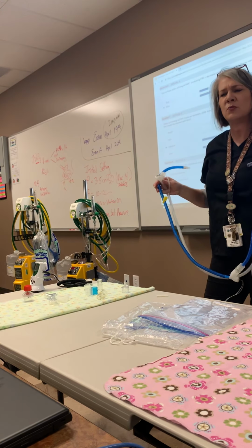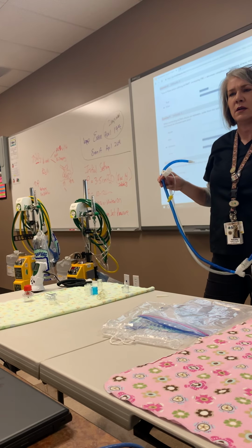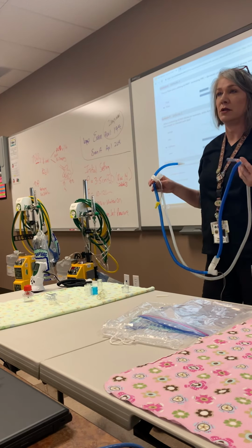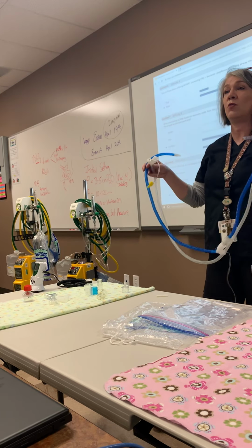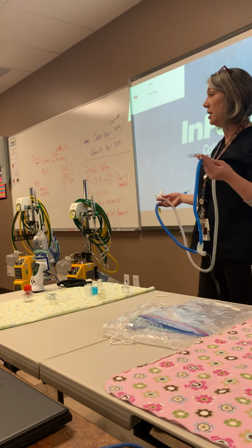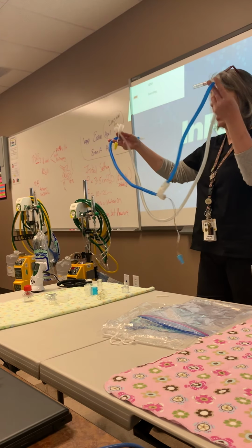And what did you put down? You put heated wire? Heated wire neonatal circuit. Perfect. Please make sure that you say neonatal. So heated wire neonatal or neonatal heated wire circuit. Because I'm not going to use a pediatric. I'm also not going to use an adult circuit. It has to be a neonatal.